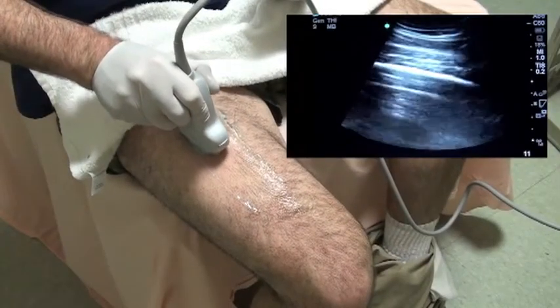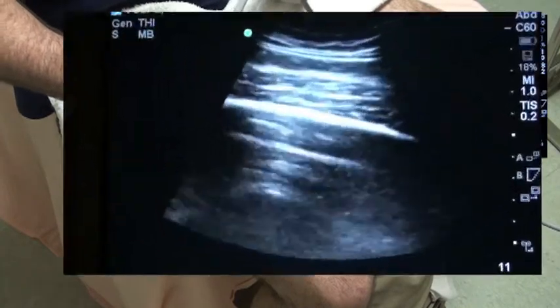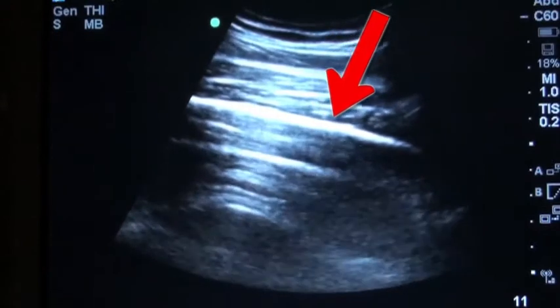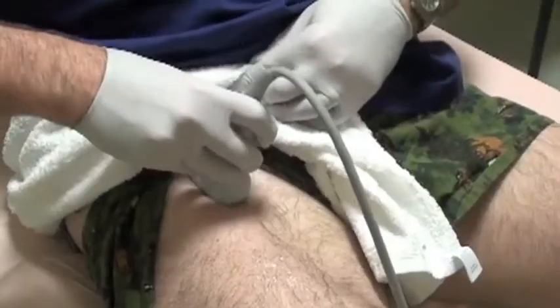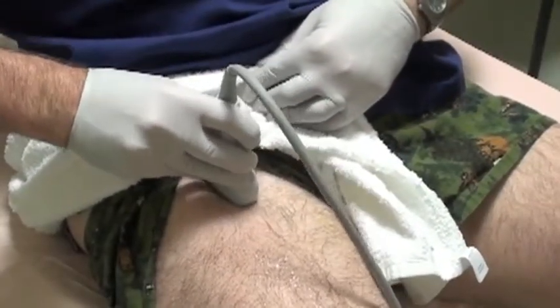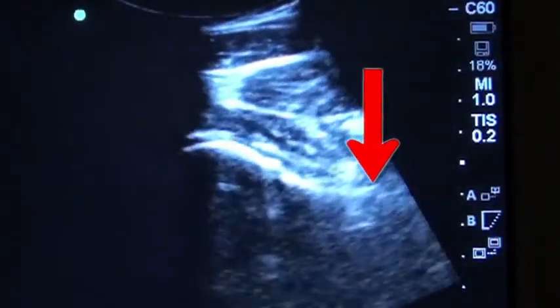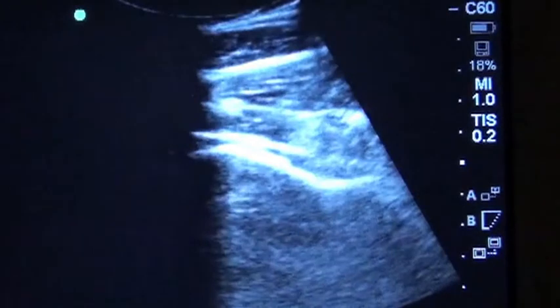It's also pretty easy to look at the femur in the long axis like this. Here again is the cortex, that bright white line, and you can even get a pretty good view of the hip. Here is the head of the femur and here is the neck right here.